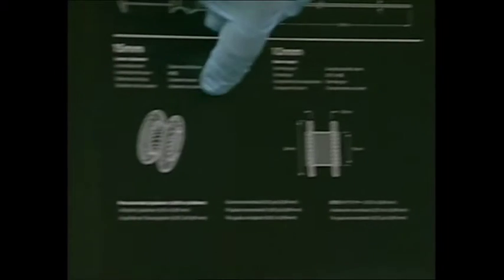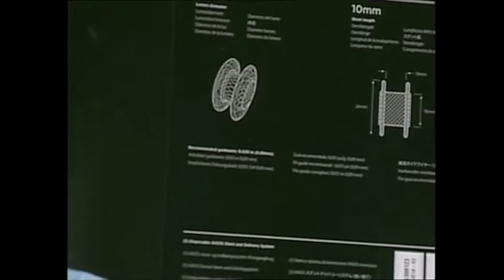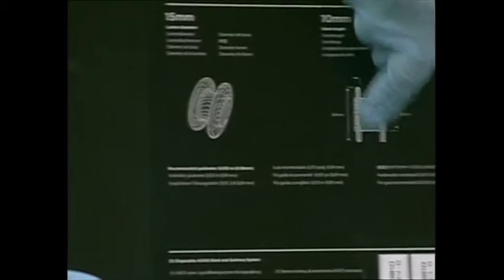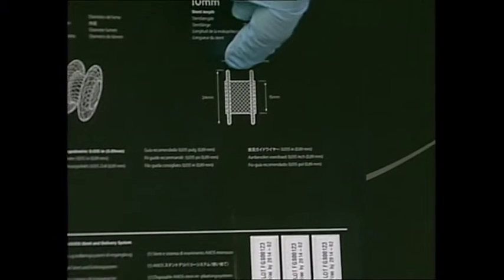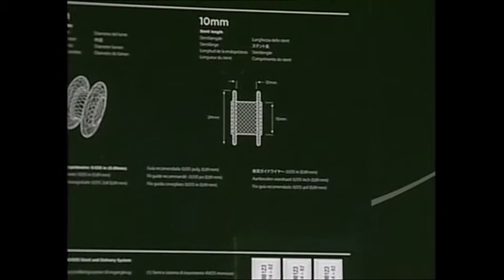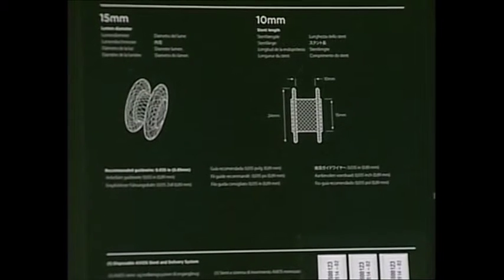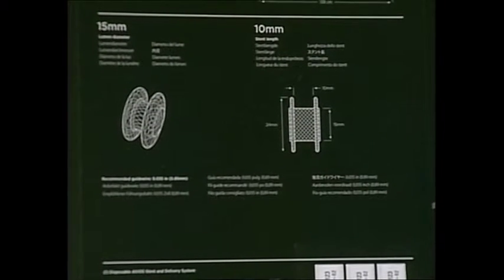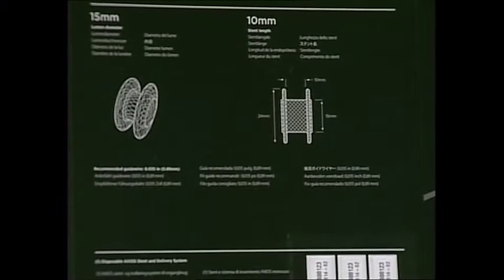And this is just another image of that stent. So in the center is a covered stent. Yes, in the center this is fully covered with silicone. Okay. And the flanges are covered as well. So the entire stent is covered. And that covering is, of course, important to prevent leakage. But of course you have the lumen apposition holding the walls together, and that also prevents leakage between the two cavities. And now we can just move quickly to show the tip of this.